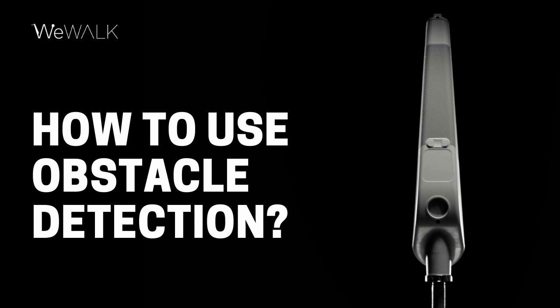The best way to get to know WeWalk's obstacle detection feature and to find out what works best for you is to simply go out and try it. Experiment with different sensitivity preferences to see which obstacles are most important to you.